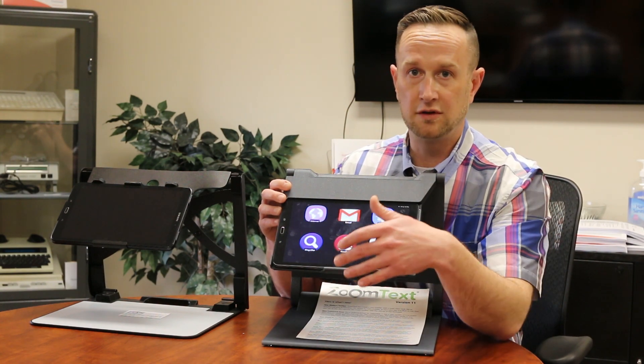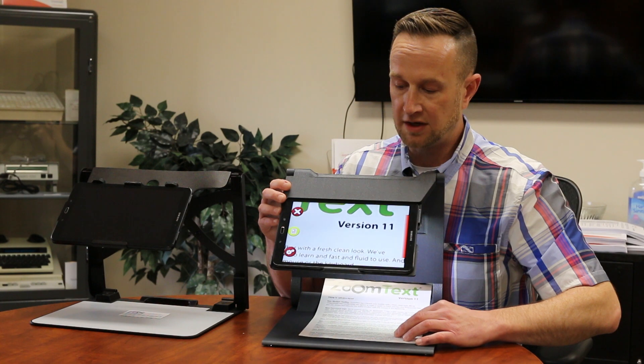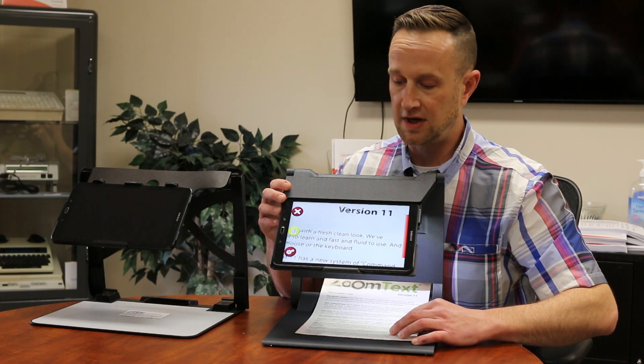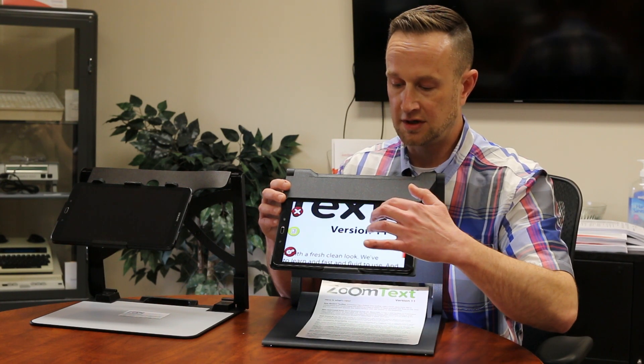All you have to do to initiate any of these is just tap on the icon. With the magnifier, you just take whatever material you want to magnify and put it underneath the magnifier. Just like any other, you can zoom in and zoom out, and you can change the color contrast.